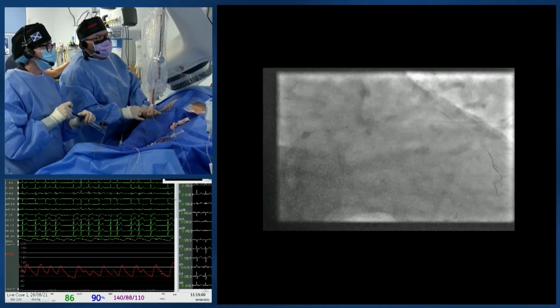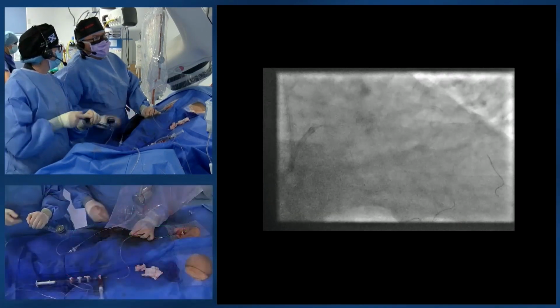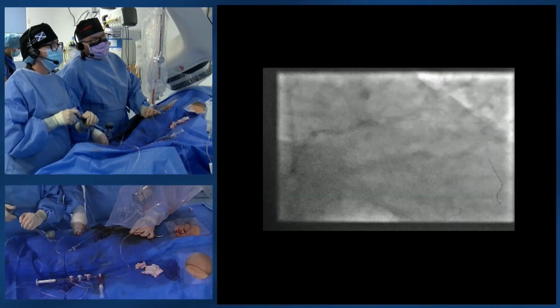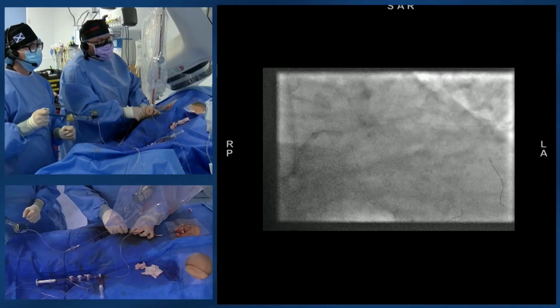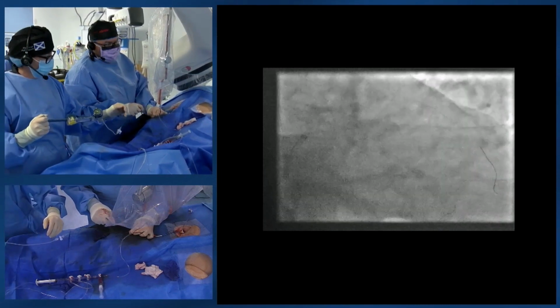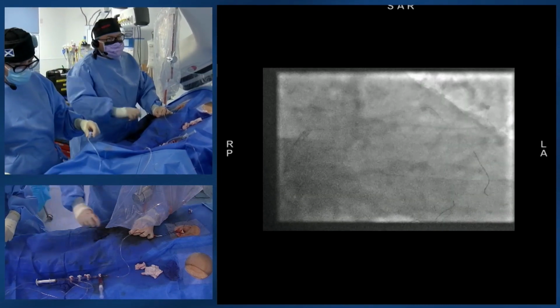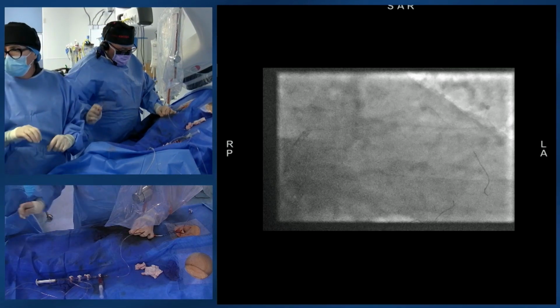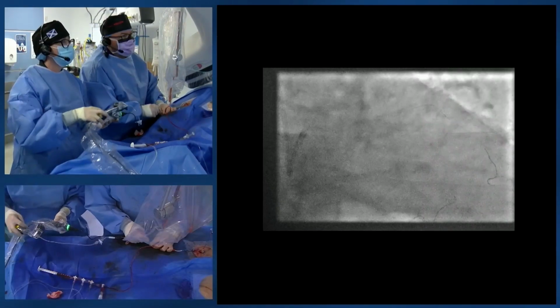Okay, so next step, shockwave, Stuart, do you think? I think so. I think a 3.0 shockwave, you say, so we can use it in the left main stem as well. Would be a good idea. Now, obviously, you get 80 pulses with the shockwave balloon. They all come in 12mm sizes, so we may need two, but we'll try and use one, so let's have the 3.0 shockwave. Fiscal responsibility.